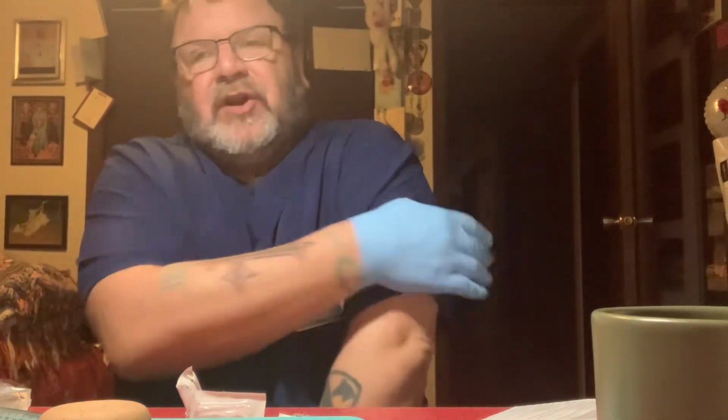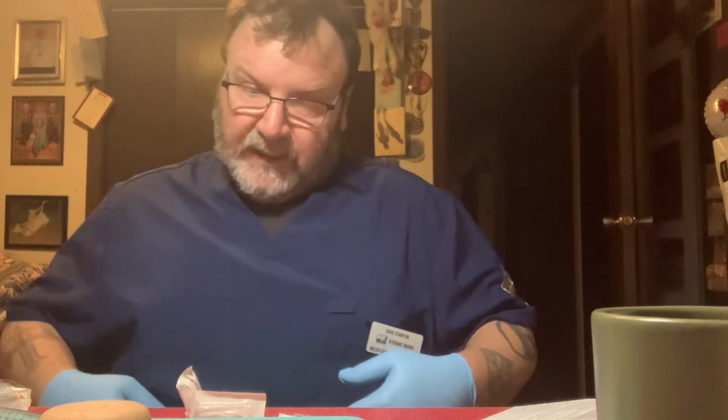Actually, this says to give it on the abdomen. The sub-Q would be appropriate in the back of the arm, but for purposes of the abdomen, I would go away from the umbilical, making sure that I'm far enough away from that, over into the subcutaneous tissue on the sides of the abdomen. I'll just pick one side. I'll do the insulin on the other side, so I would just pick the right side, making sure that I'm an inch over. I would have the patient properly positioned so that I could do that.